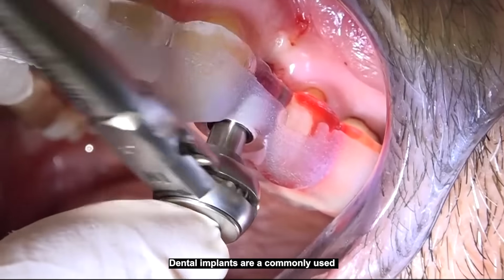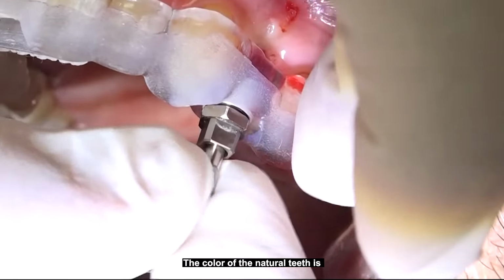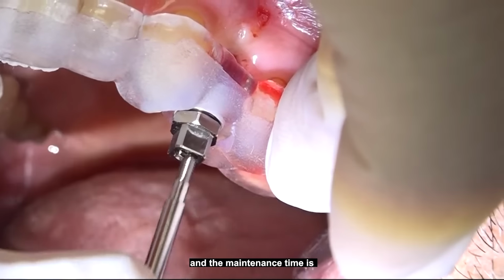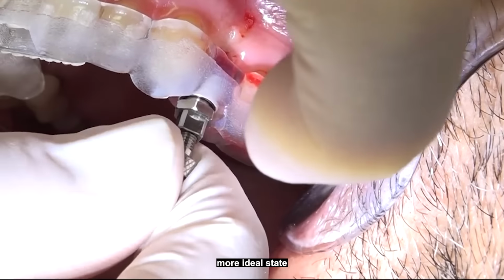Dental implants are a commonly used tooth restoration method in the Department of Stomatology. The color is very similar to natural teeth, and the maintenance time is relatively long. By using surgical guides, the dental implants can achieve a more ideal state.